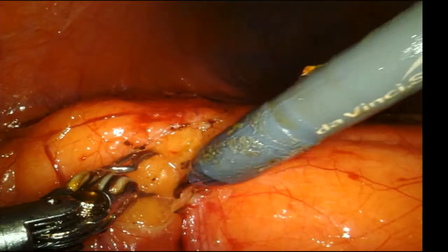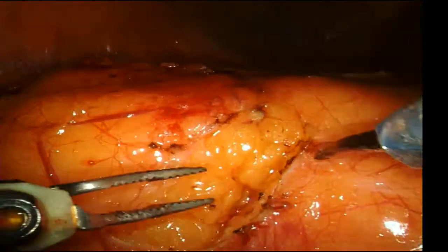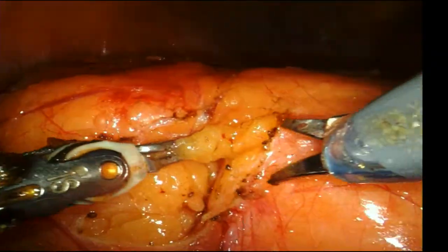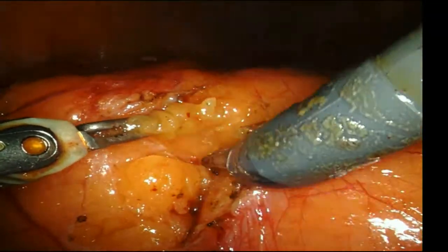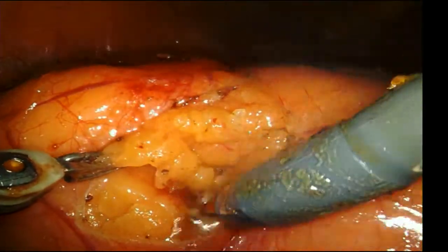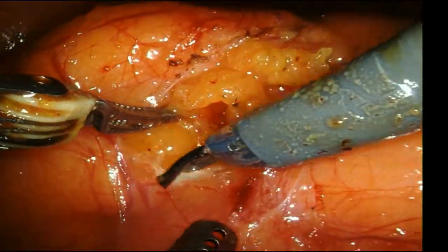So one thing that I tell surgeons who do these procedures or somebody who might be still learning how to do it, I tell them, your ischemia time is going to be about 10, 15 minutes, but your operative time is going to be about 2 to 3 hours. So that means that you're spending 10 times the amount of time on setting it up so that your ischemia time is short.